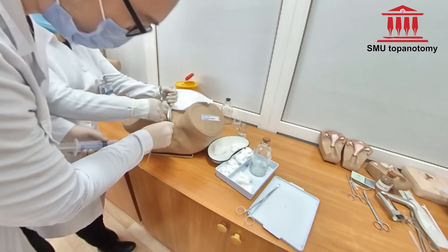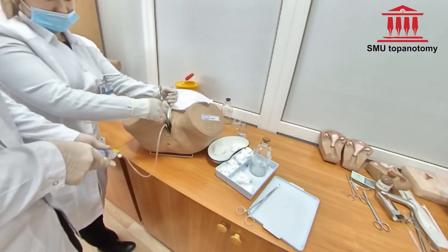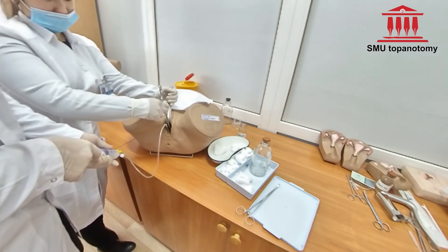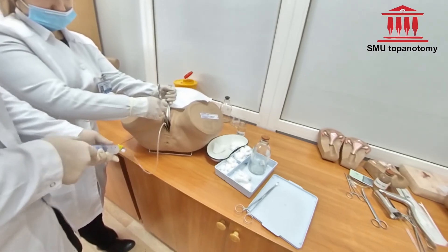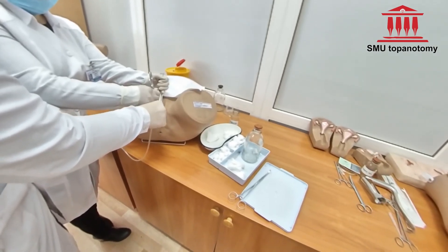On needle insertion, there should be a feeling of the needle falling into free space. Pull the syringe. If there is no liquid visible, you can readjust the needle by pulling and pushing back and forth carefully.